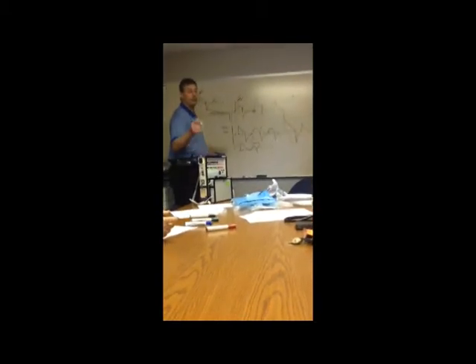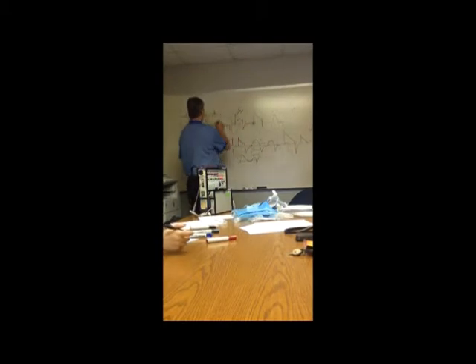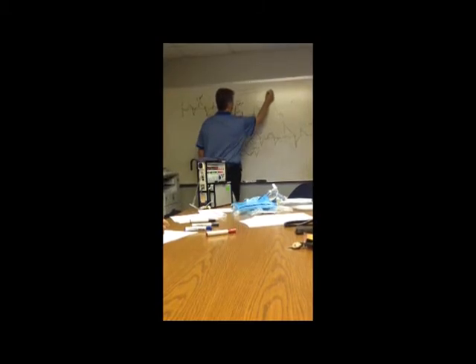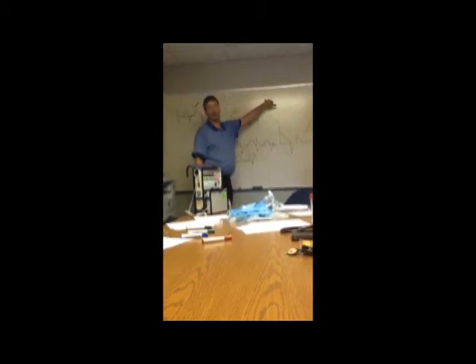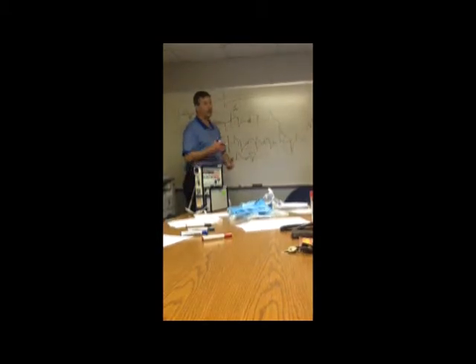The only time they'll do that is if you've got somebody who's big time wheezing. They want to let them control the start and the stop, because those people, when they exhale, it takes forever before it gets to where there's no air coming out. All right? So I mean, this could be 10 seconds. That don't leave a lot of time to have a high rate, and they need a lot of air movement.